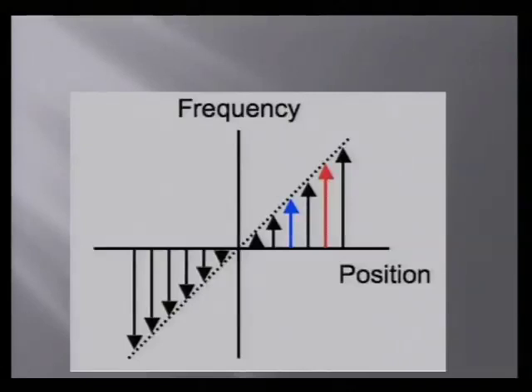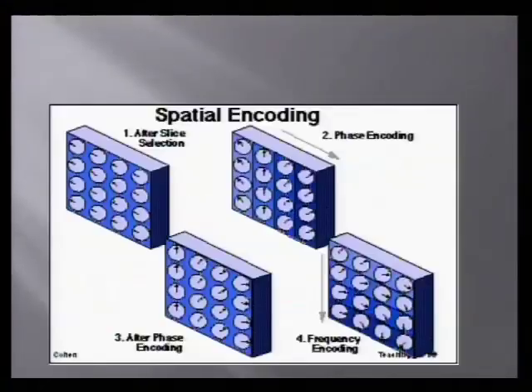And so this just kind of shows how you give what's called a gradient, and that just tries to get different frequencies of protons in space so that when the computer gets the signal, it says, oh, wow, look, the amplitude at this particular frequency is extremely high. It must mean that wherever that spatial area is that has protons of that frequency must have a lot of hydrogen protons there. That's how the computer decodes all this information to try to give us an actual image in real space. This is just, again, showing what gradients do.